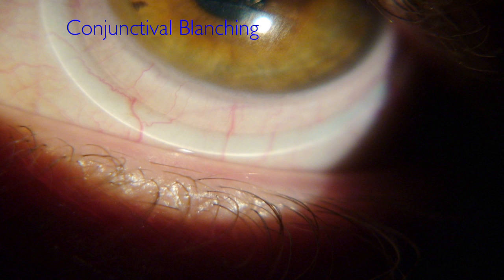If it's the same 5 minutes from now, that is unacceptable blanching. As is this. Notice the bright band. You can also notice that we're getting a little fullness underneath between the limbus and where that area of blanching is. Now that may be an illusion because we've created such a bright white area on the sclera, but that is an area that is too tight.